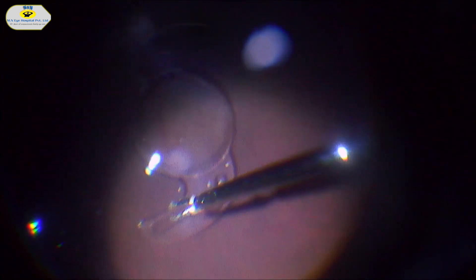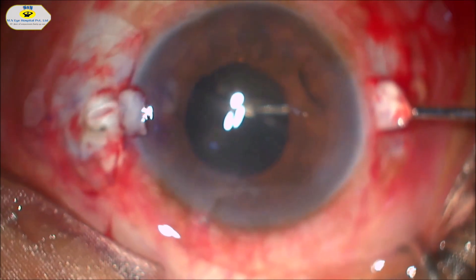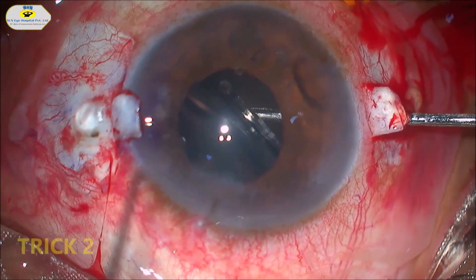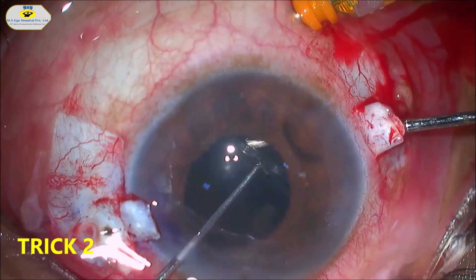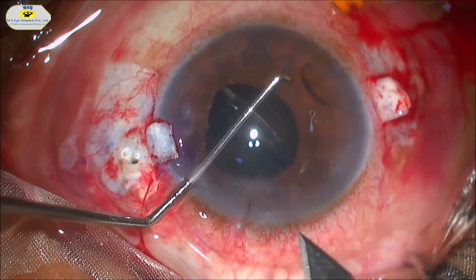The haptic of the hydrophilic intraocular lens is thick and bulkier, so it is difficult to grab with the forceps. Once held with the retinal forceps it is taken out carefully. The dialer is then passed through the side port and the IOL is changed hands to the dialer and held in the iris plane to prevent it from falling back.